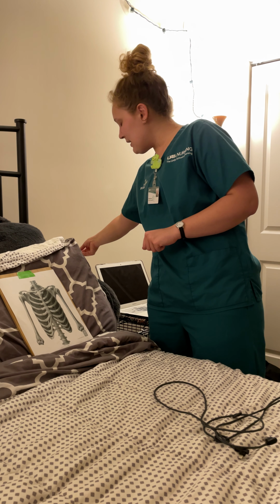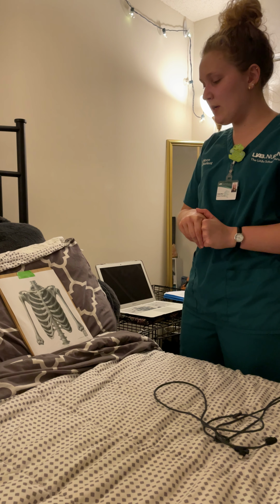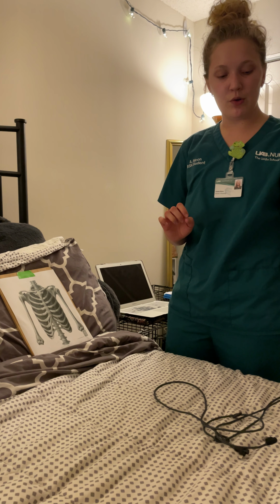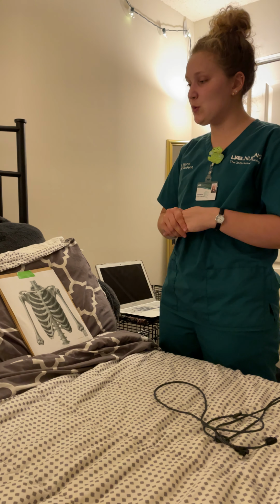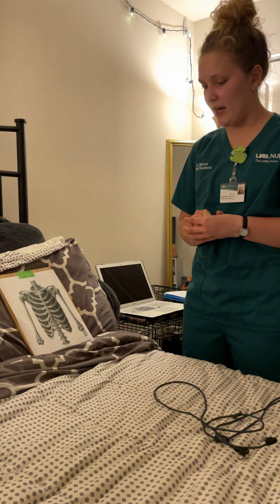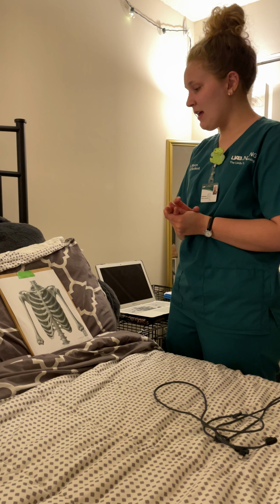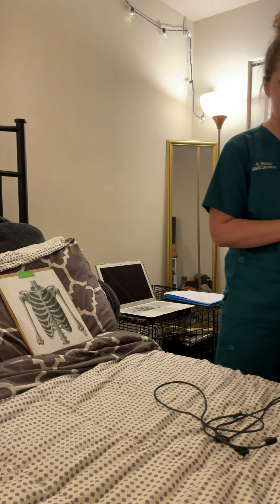I would ask you, do you need anything before I go? Do you have any questions about the procedure that we just completed? No? Wonderful. I'll be sure to go into your chart and document that we did a 12-lead EKG and that the results have been given to your provider for further inspection. And I would make sure I hand hygiene and be good to go.